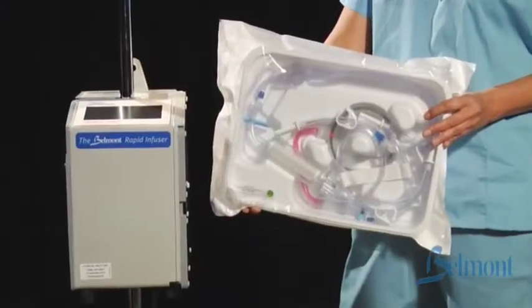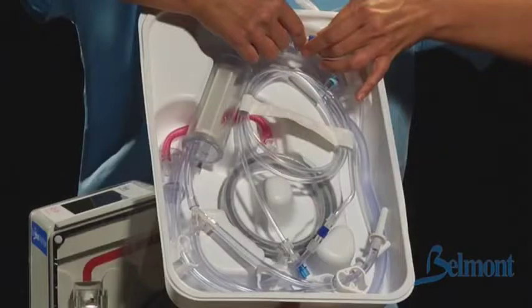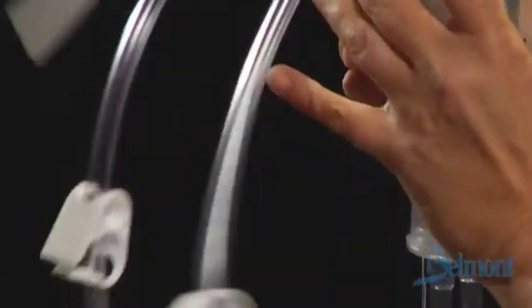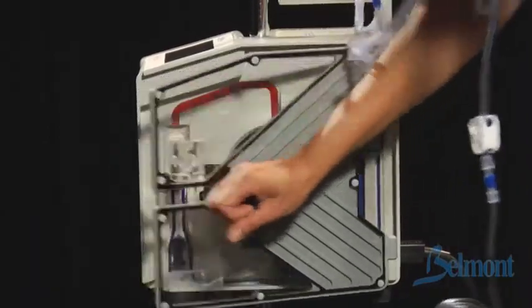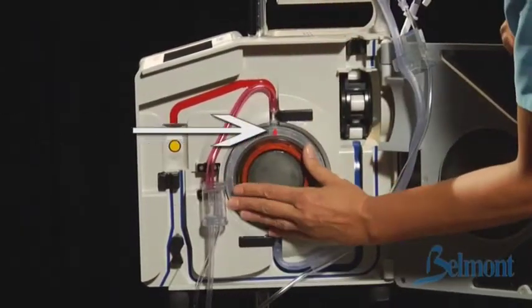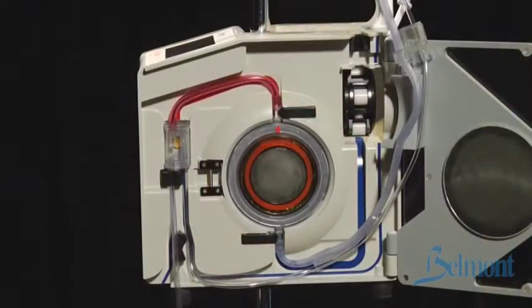The single patient use disposable comes preassembled in a sterile container. Use aseptic technique when setting up and operating the system. Begin by opening the disposable package and tightening the luer locks. Snap the reservoir chamber into the holder and open the door of the unit. Insert the heat exchanger with the red arrow pointing up, matching the red tinted tubing to the red stripe on the unit.